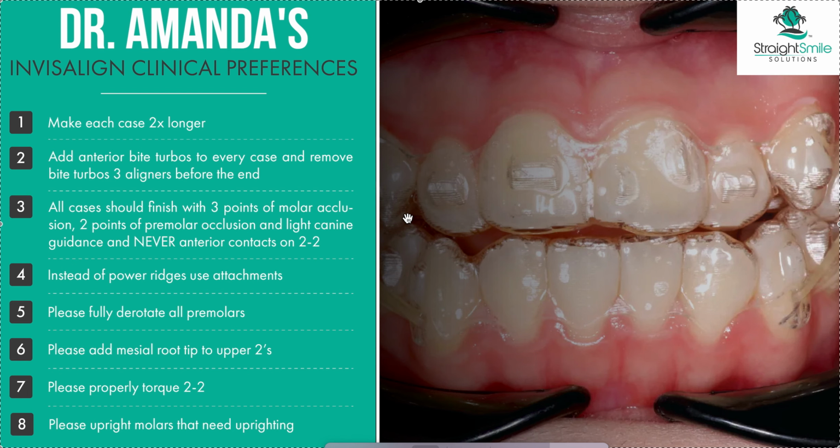These are my tips, the main things you want to look at, the main things that I ask on every single case. And if you do work with us on your cases, these are things that you will learn as we go over cases over and over and over. You can see our comments. You can see how we do it. We can do it together. We can help you learn to do it.